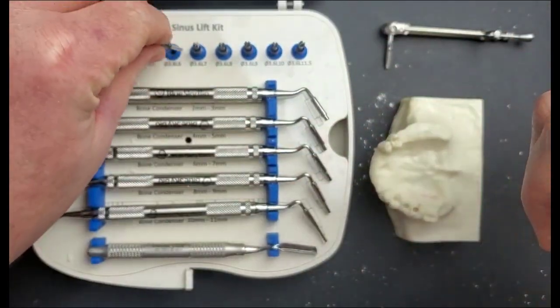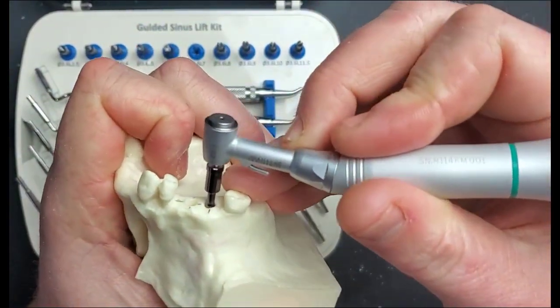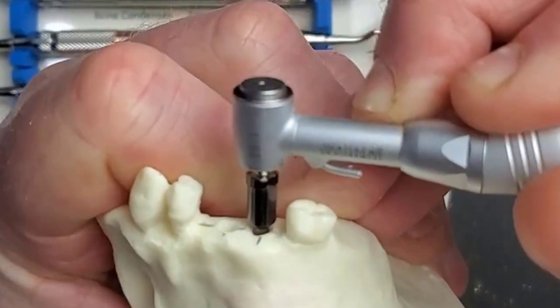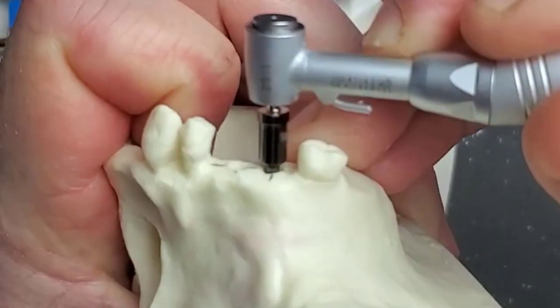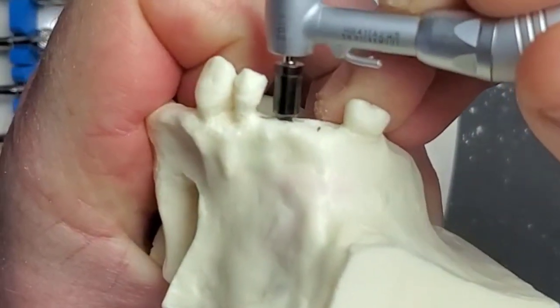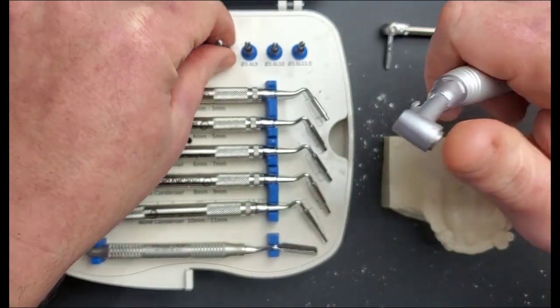I'm going to switch out and go to the seven millimeter length. There's no way just from tactile sensation to know when you've broken through the sinus floor, so you want to make sure you learn that by whether or not the stop goes all the way to depth. I thought I would break through on that last drill, but as I'm seeing there's still a gap between the bottom of the built-in key and the crest of bone. So I'll step on the pedal and go one millimeter deeper, then repeat the process on the front — still not through, step on the pedal, go a little bit deeper.